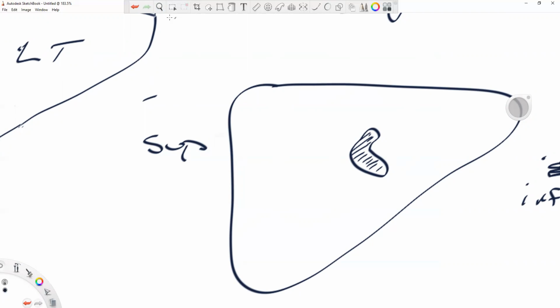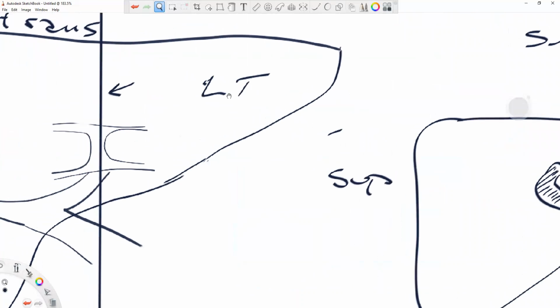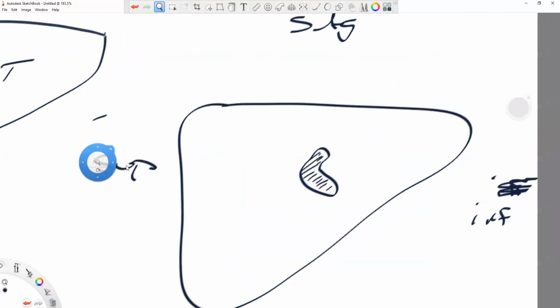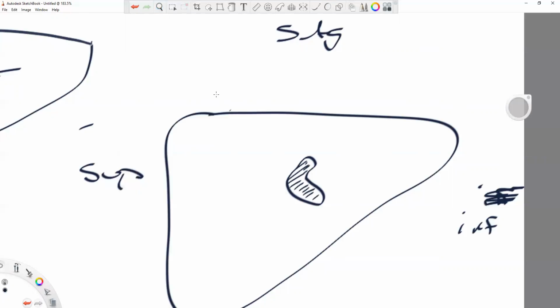Now, what's really nice about this picture, we already mentioned in the transverse picture that we can oftentimes see either a triangle or a little fuzzy, or sometimes even a line going down to what was the head of the little man. In sagittal, we definitely should see a line, and it's going to look something like this, if we catch it just right. On some people this is really bright, on other people it's not so bright at all.